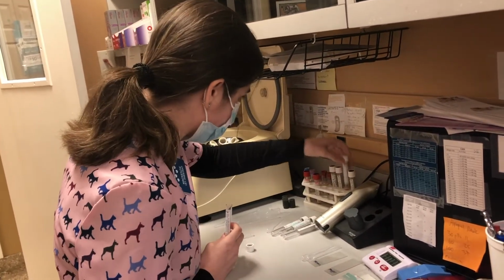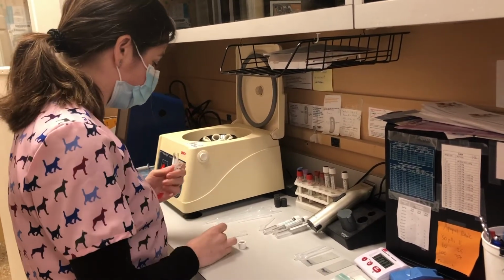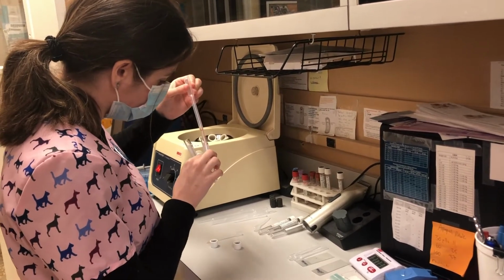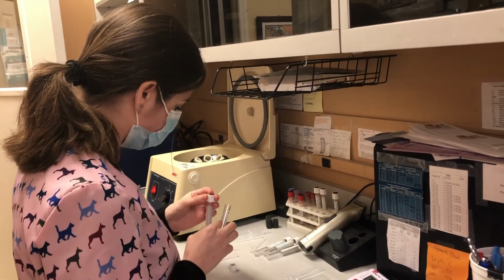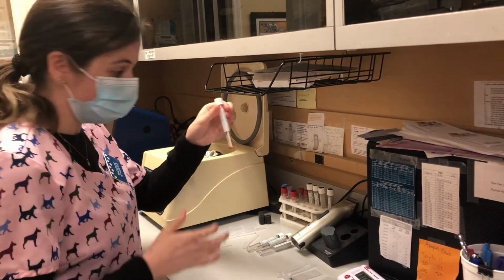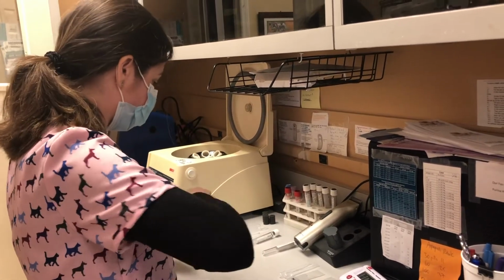And then I'm going to take my donor cell suspension and put 2 drops of that in with it. So now I have my major cross match right here. And next I'm going to do my minor cross match.